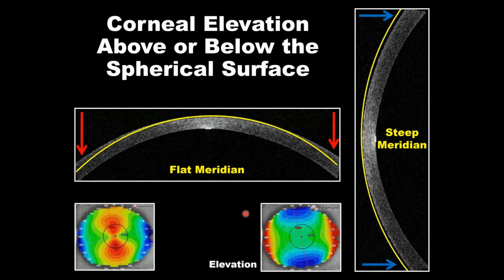And that's seen in these images, where you notice from the OCT, the corneal thickness, the yellow line is dropped on the eye as a perfect spherical surface. This is the best fit sphere. It's aligned in the center at the peak of the cornea. Where that spherical reference surface would fall in or dig into the cornea, that's where you see the red on the elevation map.